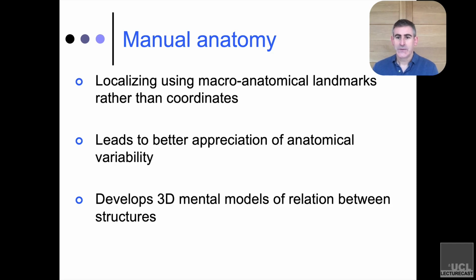So all of those are tools to help you, as far as I'm concerned. First, localize your anatomy, or localize your activations, but second of all, learn the underlying neuroanatomy so that the next time you run a study that's related to this area, you're more likely to be able to do it yourself, manually.